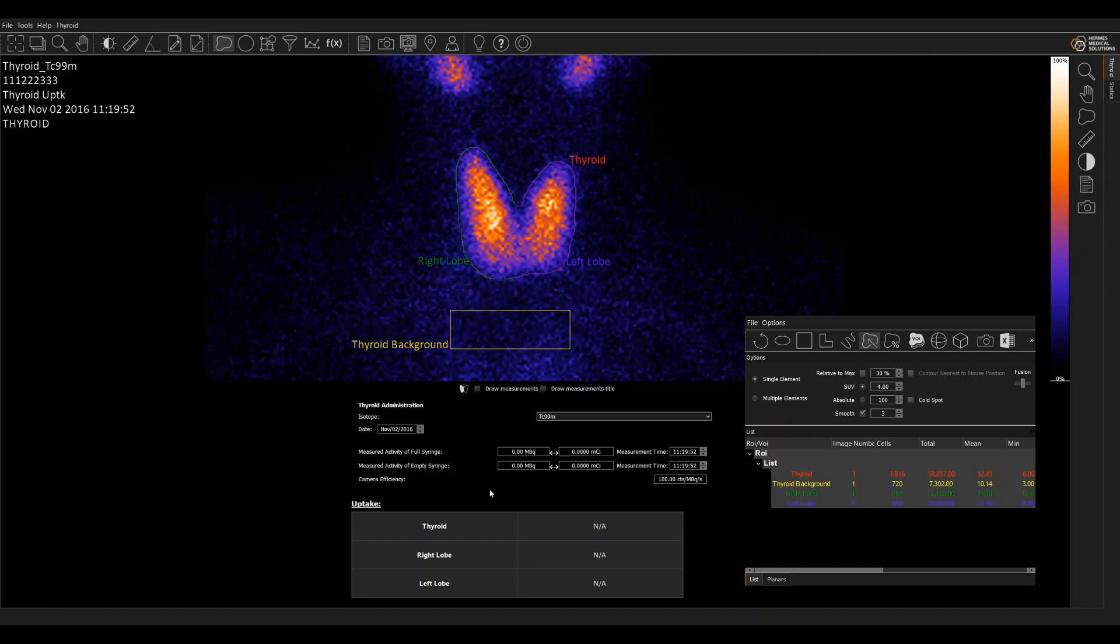Now I will type in here the full syringe activity. So let's just say that was 100. We could type in a residual if we had one here. This camera efficiency is saved in the protocol. So you'd have to measure that separately and enter that for the protocol to calculate the uptake here in the thyroid.